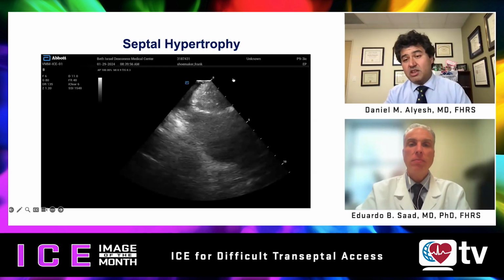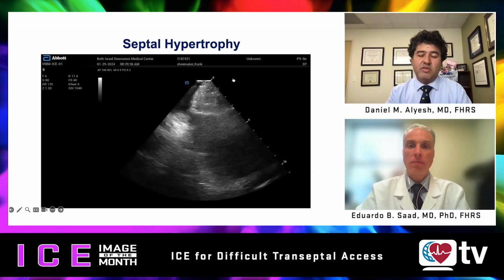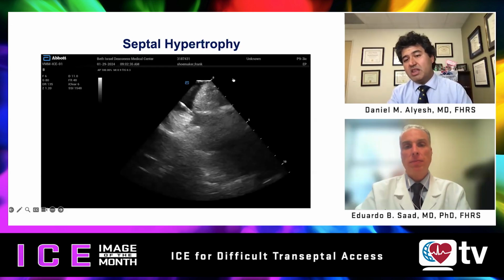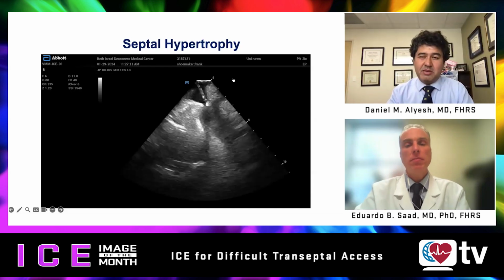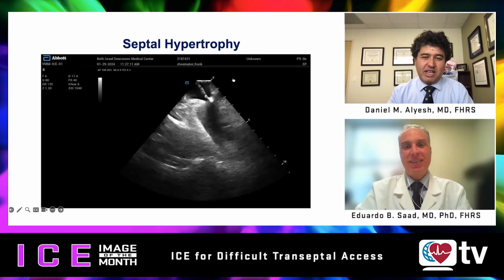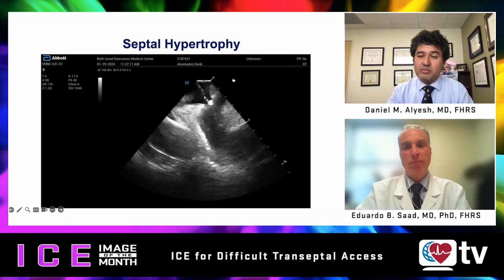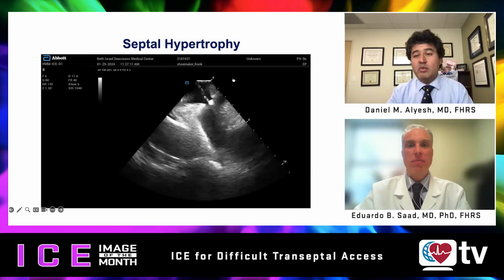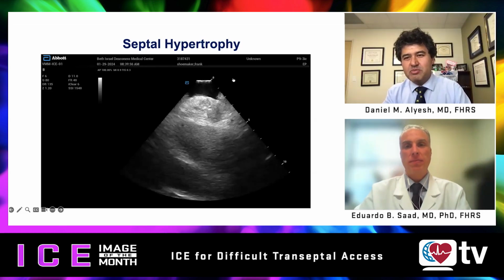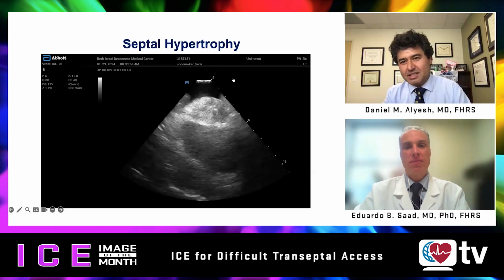No, I agree. And I think your point about left-sided ICE, advancing your ICE catheter over the wire, by the wire to get into the left atrium, night becomes day, right? As you said. And left-sided ICE, I think, is growing in popularity in the era of PFA. More to come on that. I know that you're a big proponent, as am I.